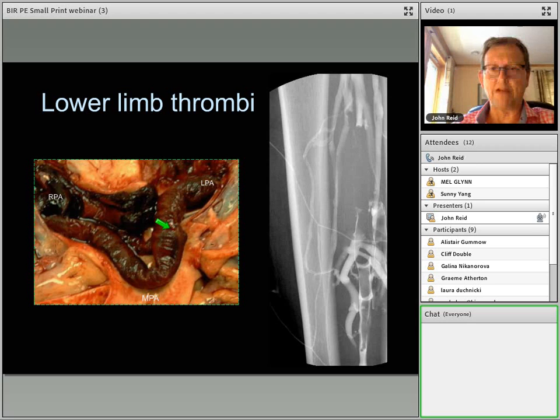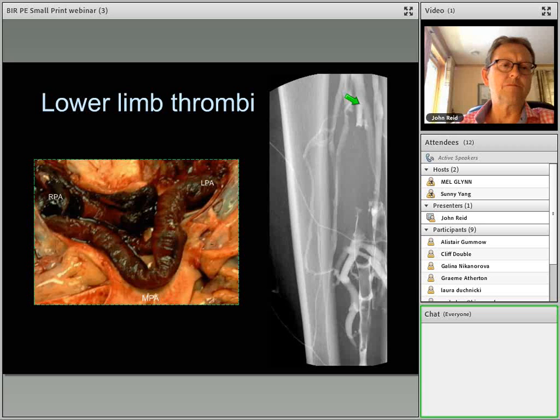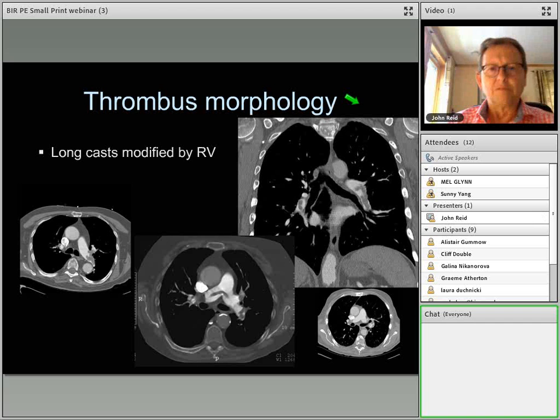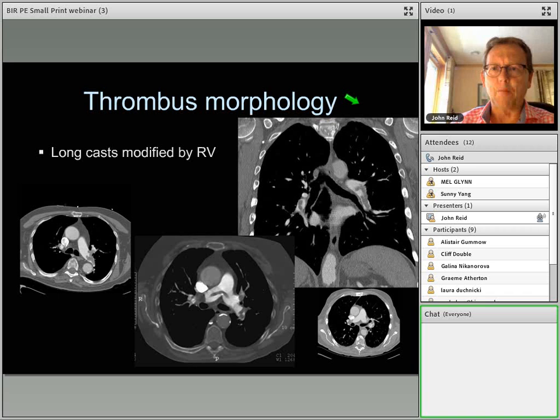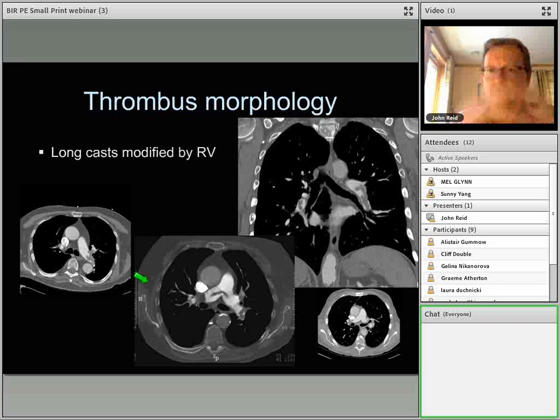An old-fashioned venogram shows one of these long thrombi in the femoral vein — these are the things that cause the damage. These long casts don't always remain stable; the right ventricle and tricuspid valve are capable of chopping them up into segments and distributing these to the right and left pulmonary arteries. So these almost spaghetti-like emboli can get chopped up into segments visible in both pulmonary arteries.